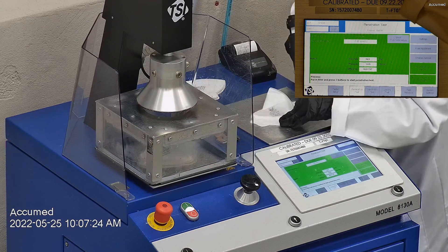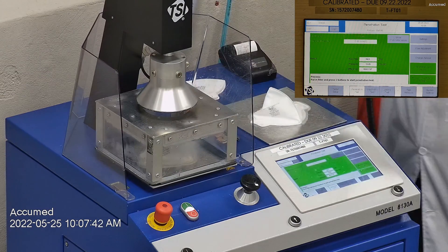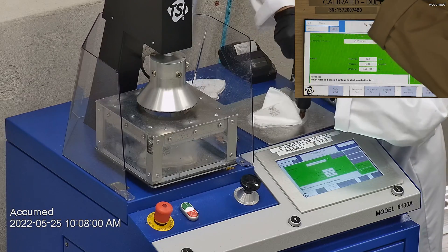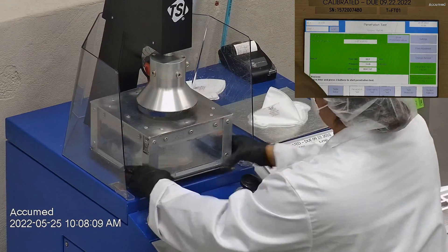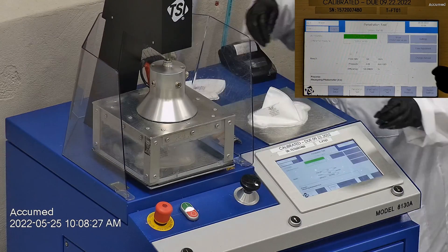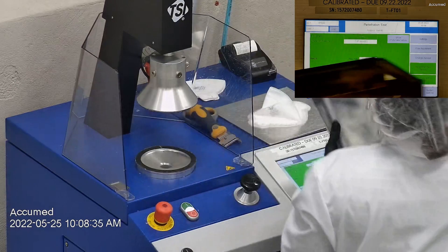The results are displayed on the TSI monitor. F stands for airflow rate, which we test at 85 liters per minute. R is for resistance, also referred to as pressure drop — this correlates with breathability, so the lower the number, the more comfortable and breathable the face mask or respirator is. E stands for filtration efficiency percentage.